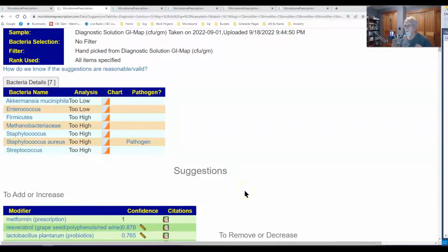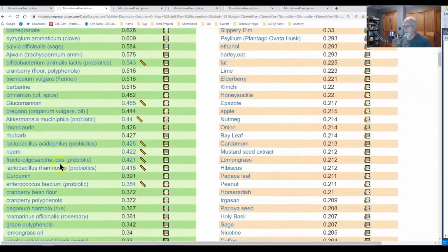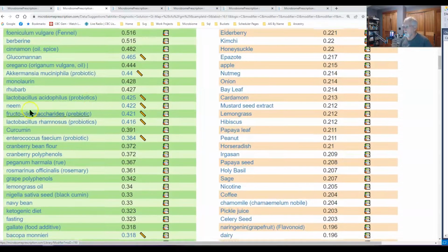Again, with a 16S sample, you will often be looking at, in some cases, 60 or 70 different things that have been picked rather than just 7. And that's the difference. And that is one I will be updating in the next day or so to include what level it is. That is a species, this is a phylum, this is a genus. So you can see what level it is. So that's basically it. Give suggestions, things to avoid, things to take.